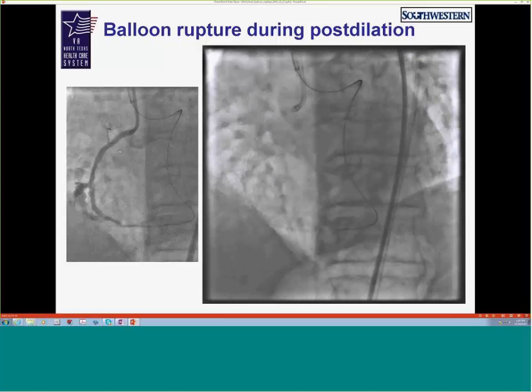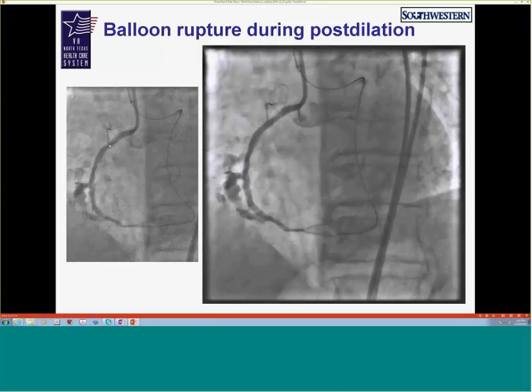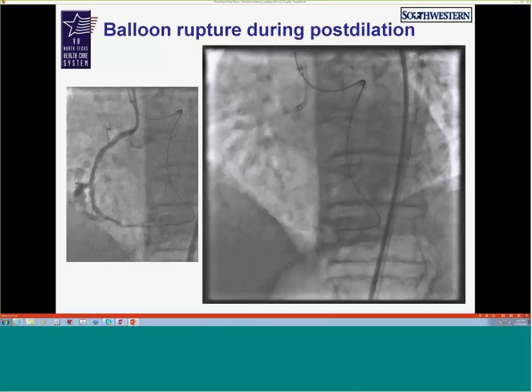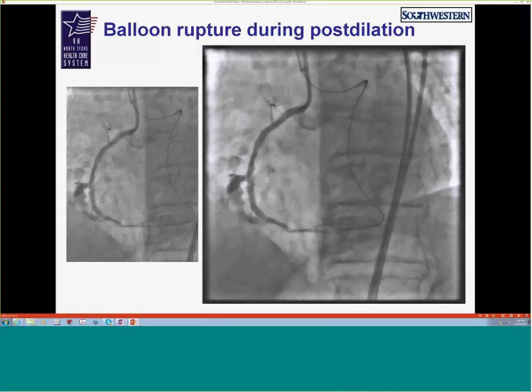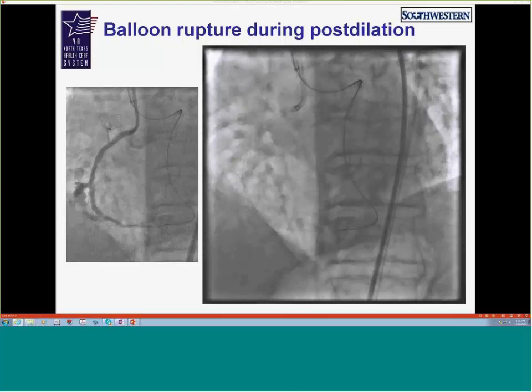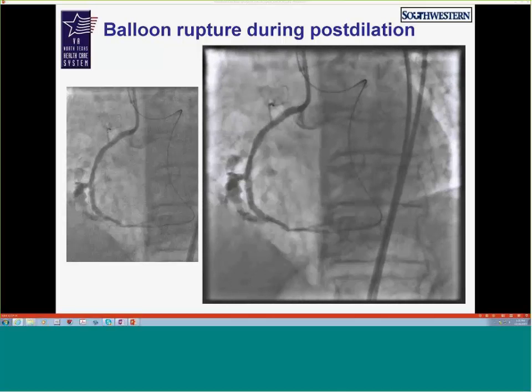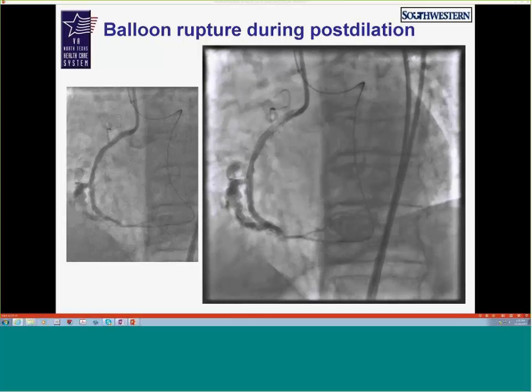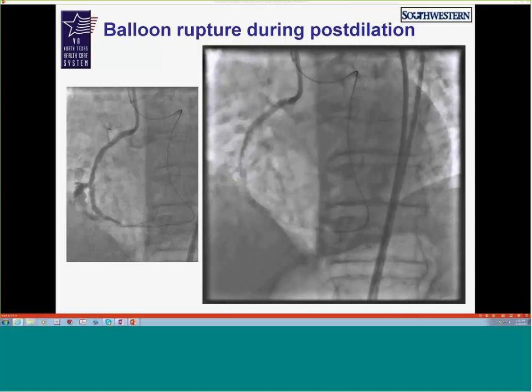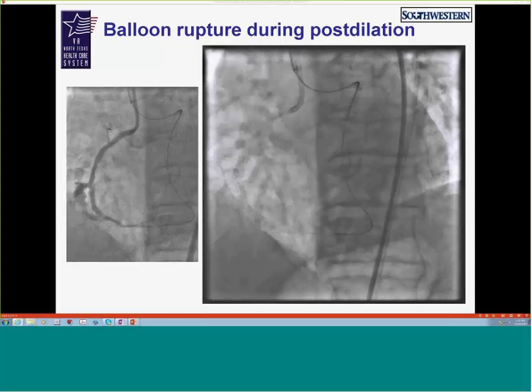And we do have an externalized wire, so we have tremendous support to deliver stuff there. And your ACT, we still haven't pulled anything out. Yeah, in one sense you're actually in pretty good shape because you can occlude that area with the balloon first, and then you have the second access site there already, and you can put a second guide into the right coronary area so that you can maintain occlusion of the perforation while you put a second system in to allow you to put a covered stent in that area. So that's the good part of this perforation at this point in the case. Did I make that clear, or was that too confusing? Yeah, that's a good point.